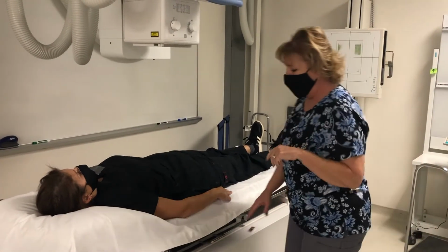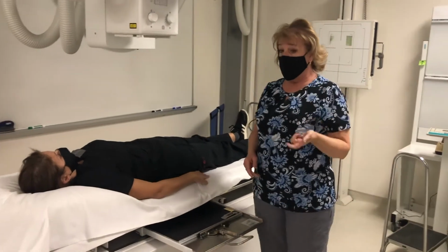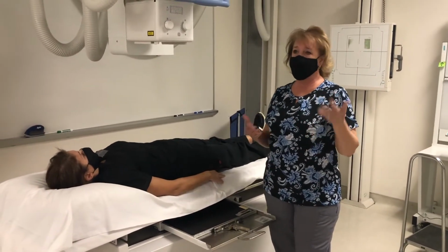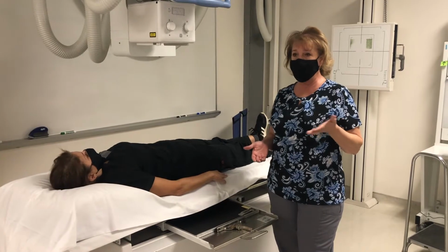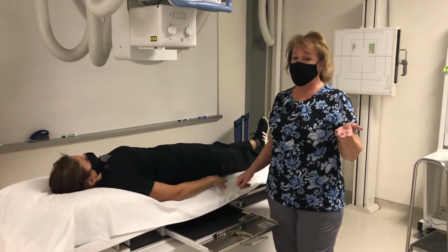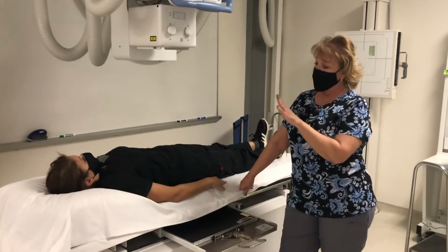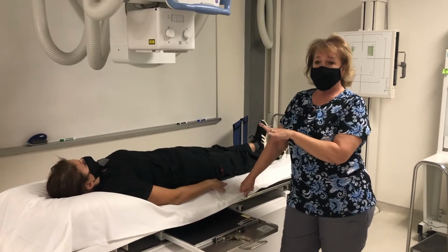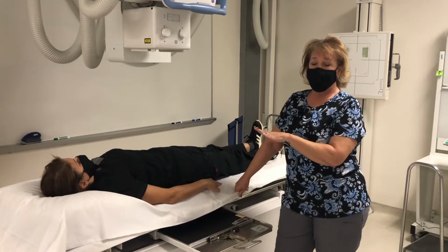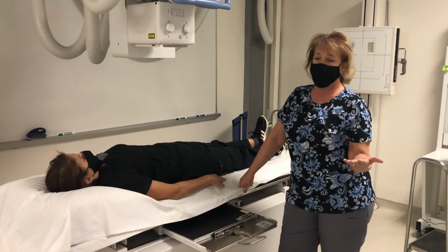So I would take this scout film, process it, show it to the radiologist, if that is the department protocol. Sometimes with IVPs, the radiologist doesn't want to be bothered. We just follow a protocol. So based on her weight, I would give her so many cc's of contrast, or mLs of contrast.